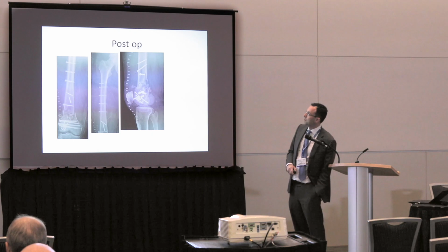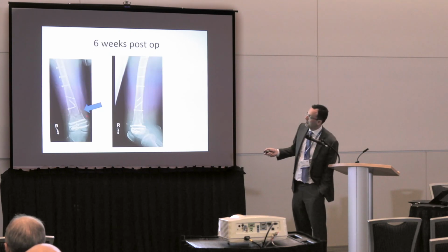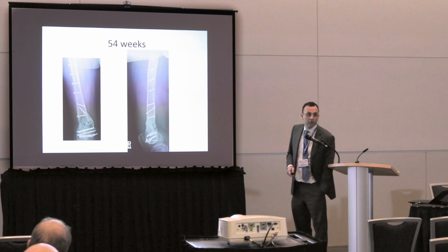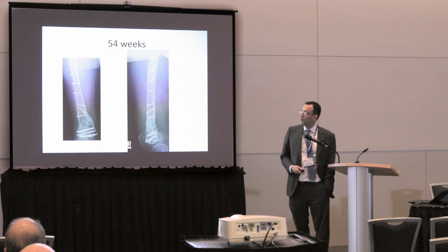Here we go. So post-ops. And then what Bruce was talking about, start notice right here, that medial callus. And it continues. And it continues. And continues at 54 weeks. And it's just remarkable how well that healed.